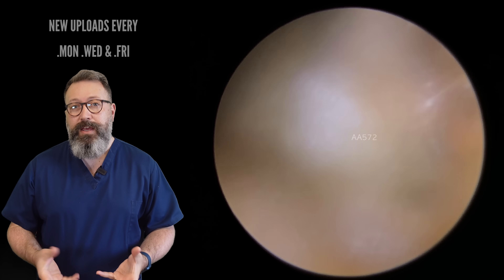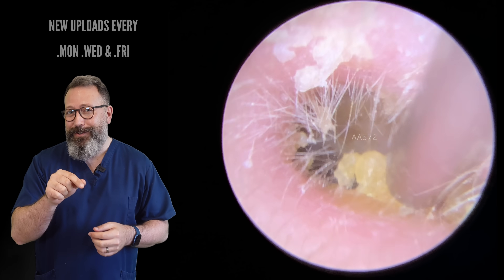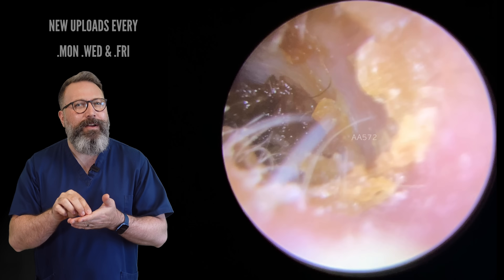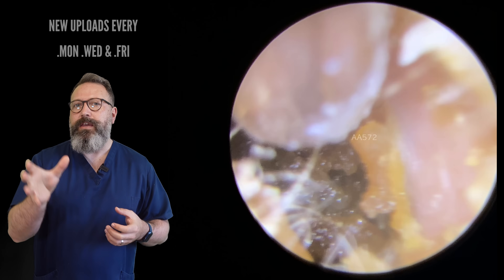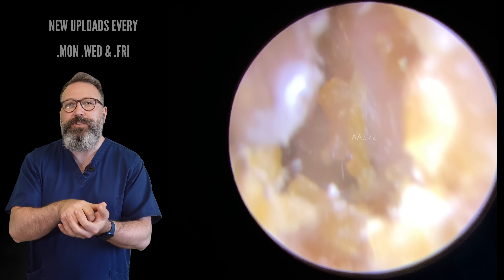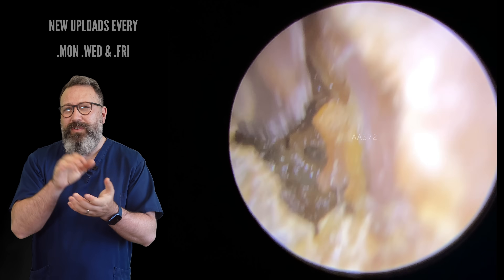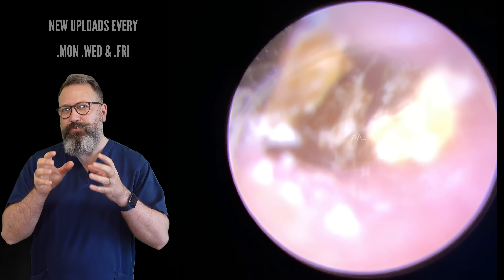Now when we look at this second ear you can see a very different, very humid ear canal. This is the ear we took the foreign body out of. I'd be interested to see whether you can spot when the foreign body comes out, because I have to be honest — when I removed it, I didn't see it first of all. It wasn't until I got the wax on the paper and noticed something glinting that I thought there was something in there. We can see a similar story to the other side: very dry wax on the outside edge and very hard dry wax deep in the canal. This is the ear the patient was experiencing a lot more discomfort with, so we're going very carefully. I was always really cautious seeing younger patients as well. We're going to get rid of some of this dry skin first before getting onto that central plug.